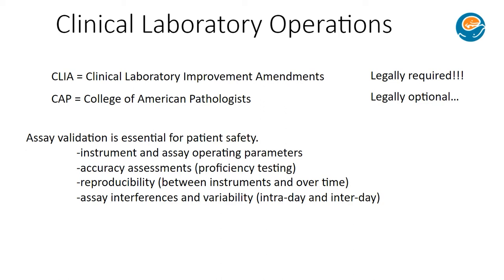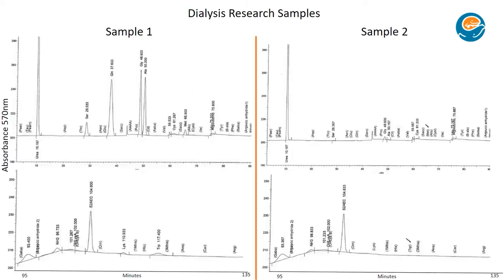This is a known problem for dialysis in its current state. And that's a lot of energy that's missed and removed from a patient when things other than the intended molecule come out in the dialysate.